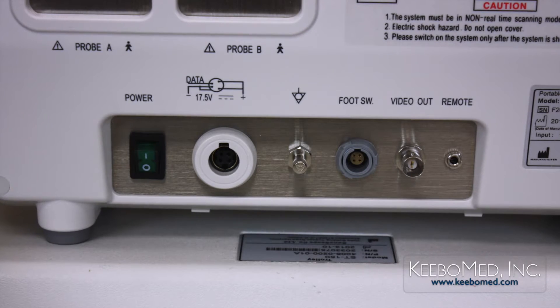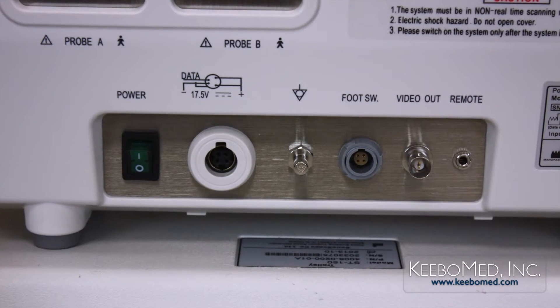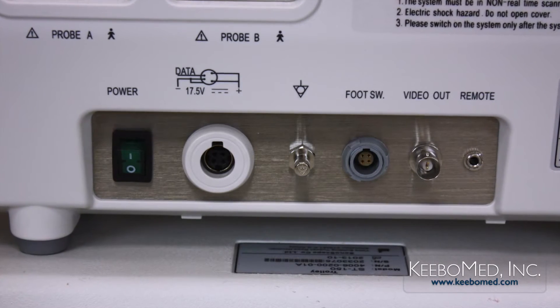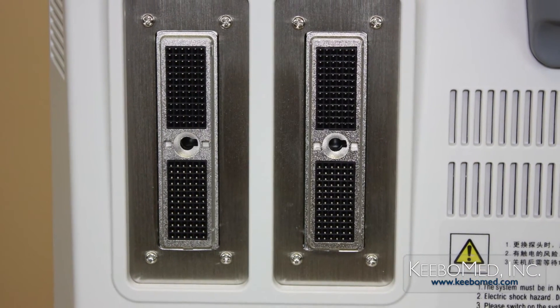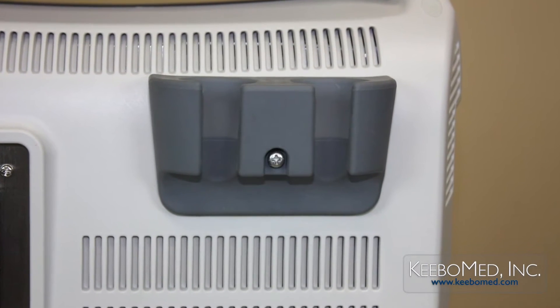On the back of the A6 is a video printer controller port, a video out port, a foot switch port, a grounding terminal, a DC power socket, and the main power switch. Above these ports there are two probe connector ports, and to the right there are two probe holders.